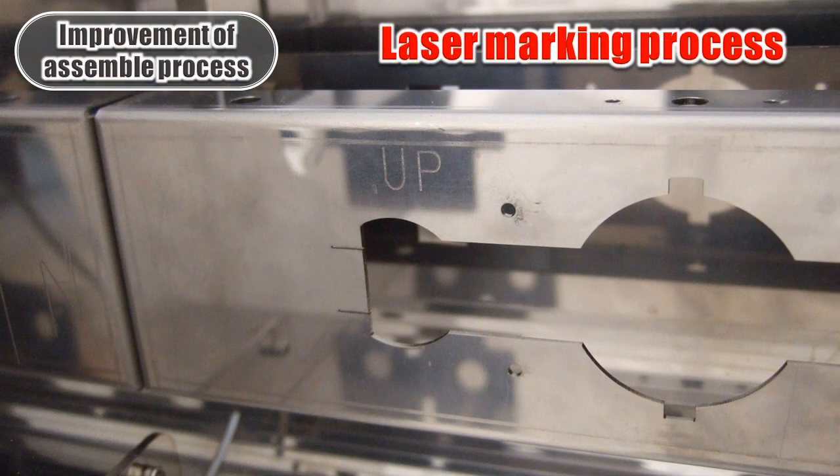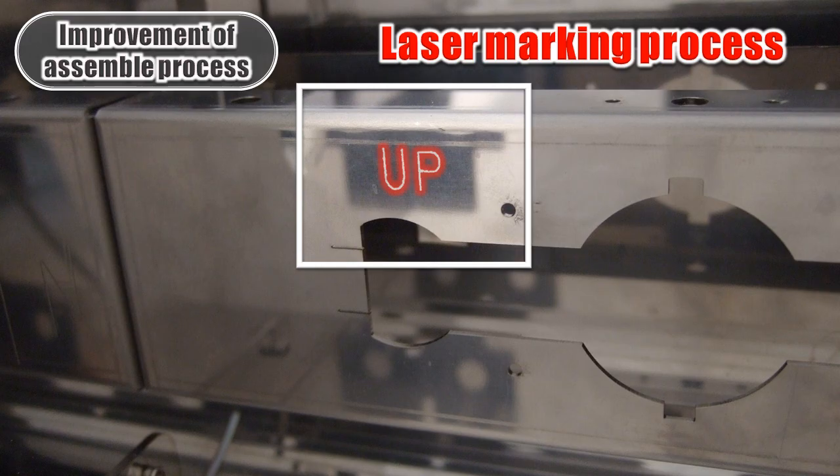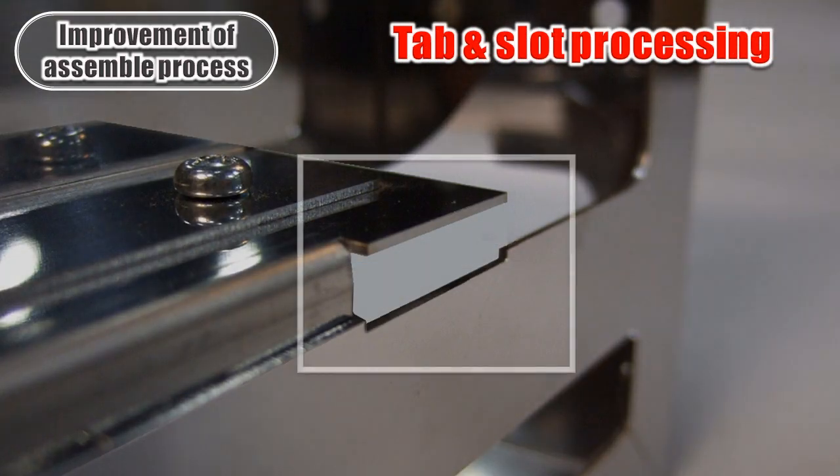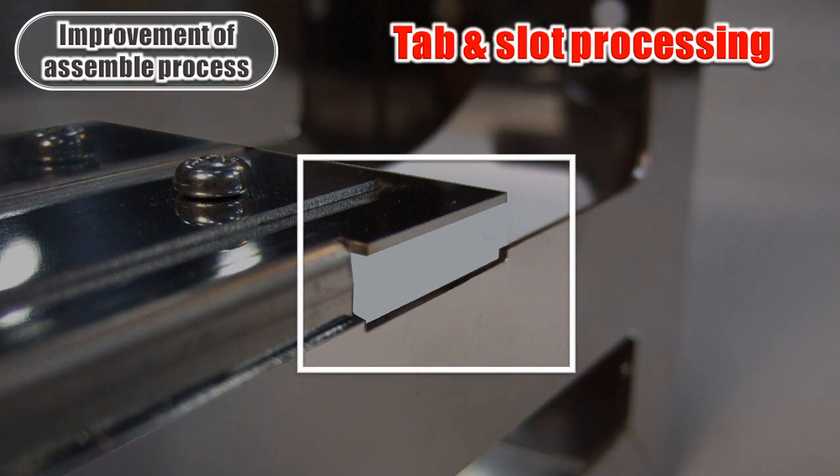Laser marks are made to eliminate assembly mistakes, top and bottom, left and right. Tabs and slots are being added. This reduces the assembly time and assembly mistakes.